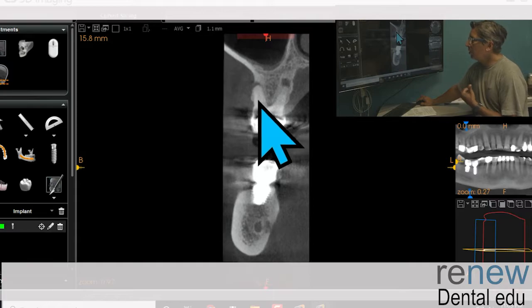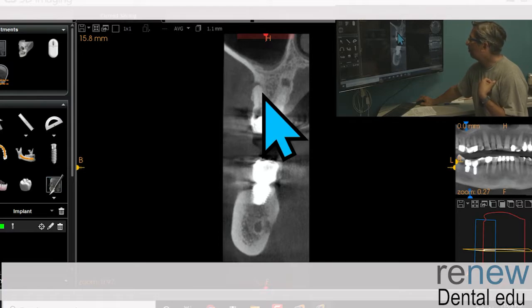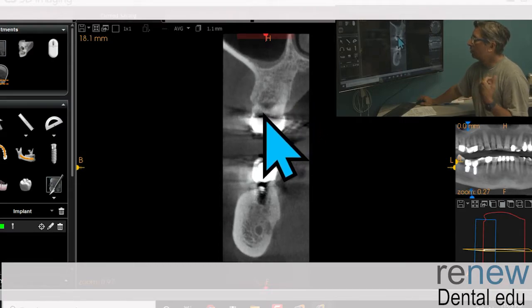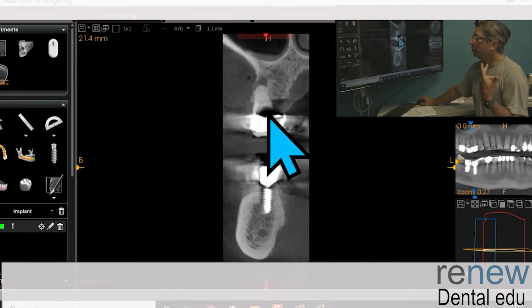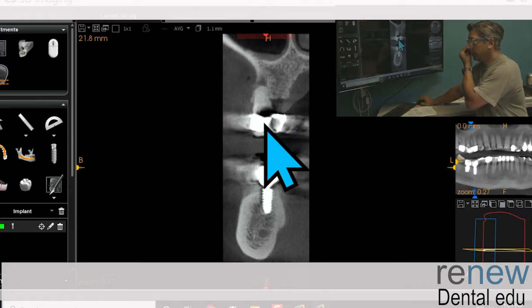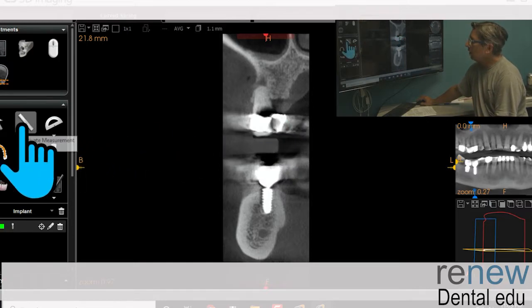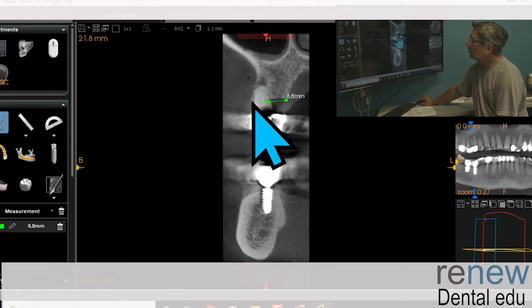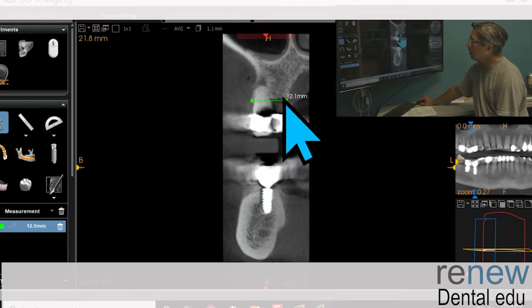It looks like there's a fenestration here on the mesial, or that's actually the distal facial root or distal buccal root, and he's getting close to it here on the palatal side as well, right here. So you want to extract this, you want to do root by root, and you want to clear out the tissue and do a traditional socket graft. Now, once that's healed, I think we're going to have some pretty predictable results. He's got a lot of heavy bone, a lot of quality bone, and so he's going to basically maintain this bone height. So that's really good.